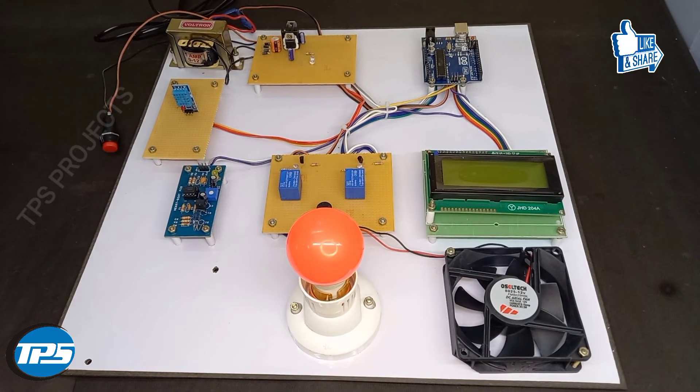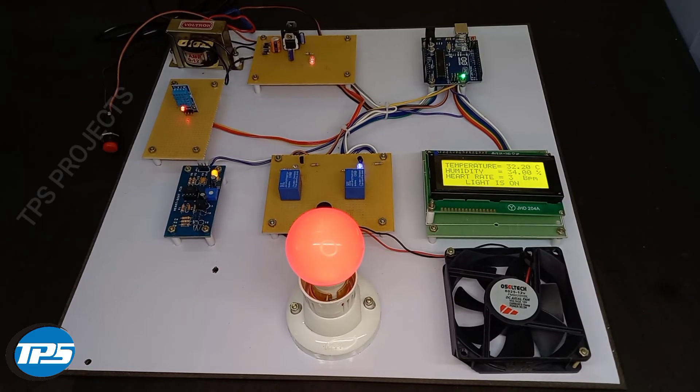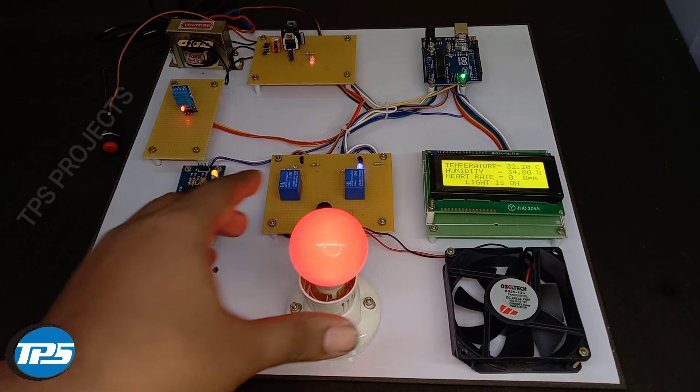Now we can see the working of the system. The temperature value is 32 degrees. It is set so that above 35 degrees Celsius, the bulbs get cut off — the heat source gets cut off — and the fan turns on.